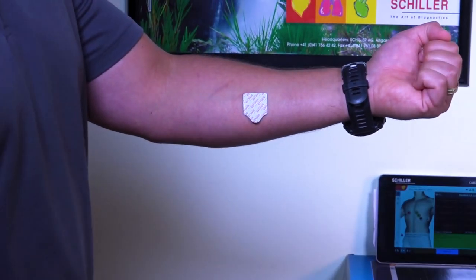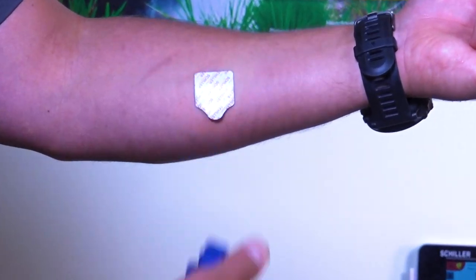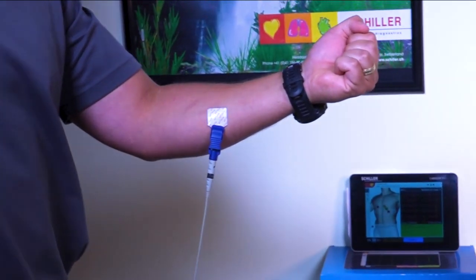Made with a high quality adherent to maintain contact for longer periods. Our electrodes work with any brand or manufacturer of ECG.